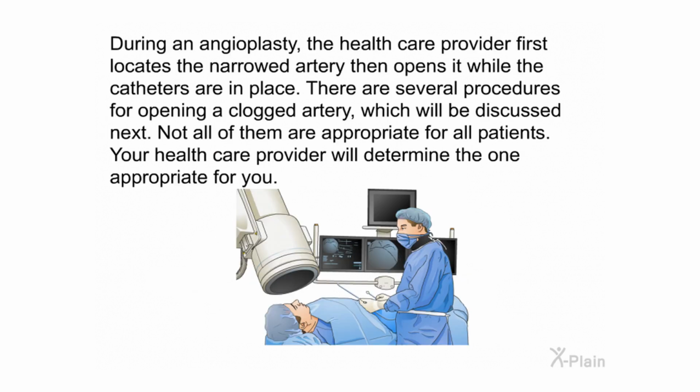During an angioplasty, the healthcare provider first locates the narrowed artery, then opens it while the catheters are in place. There are several procedures for opening a clogged artery, which will be discussed next. Not all of them are appropriate for all patients. Your healthcare provider will determine the one appropriate for you.